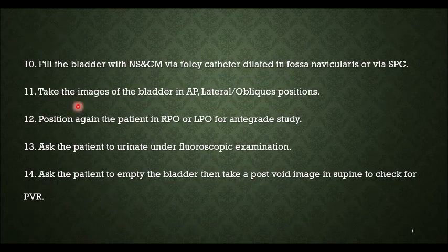Then fill the urinary bladder with normal saline and contrast medium via the Foley catheter dilated in the fossa navicularis, or via the suprapubic catheter for patients who have it. Take images of the bladder in AP, lateral, and oblique positions to rule out any diverticula. Position the patient again in right or left posterior oblique for the antegrade study.